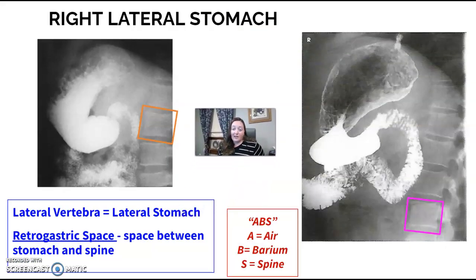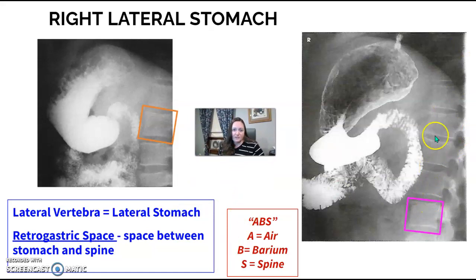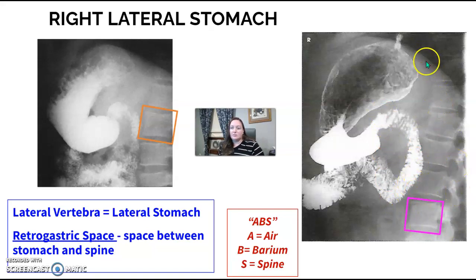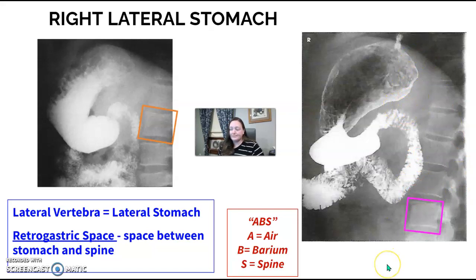For the lateral, the spine is the easiest way to identify it. If the vertebrae look like a lateral lumbar spine, it's a lateral position. The focus for the lateral is the retrogastric space — the space behind the stomach.